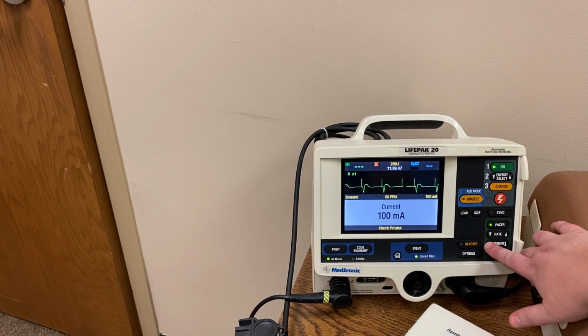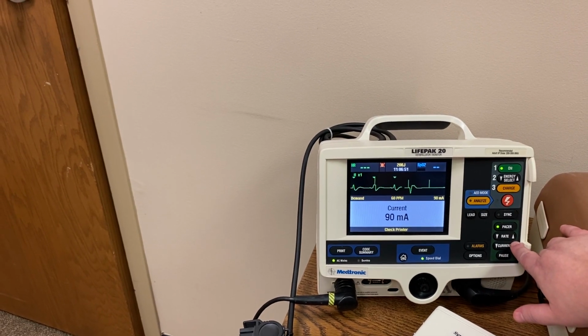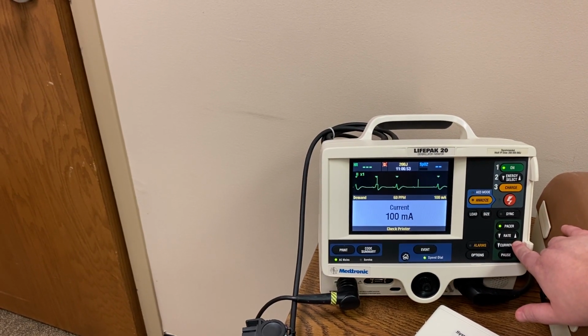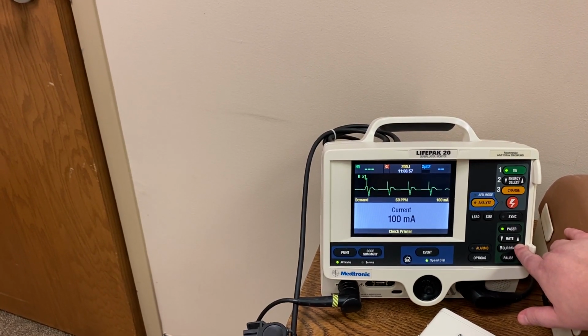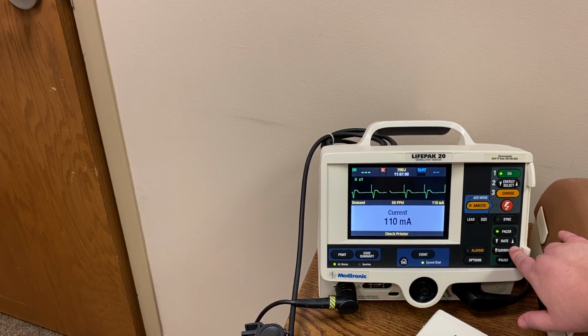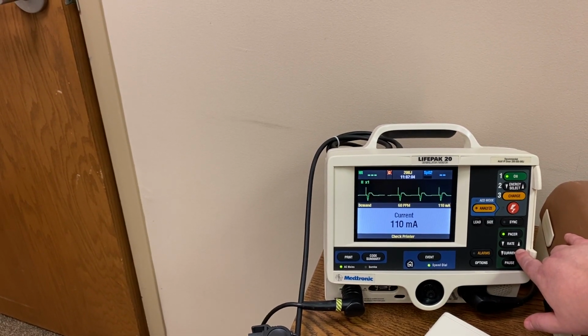So you want to go back down. Here I lost capture. Back up to 100. I have capture. Then I'm going to go up about 10 to 20 just for safety reasons, just for a safety margin for your patient.